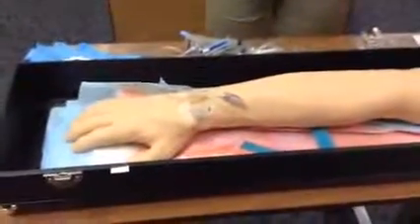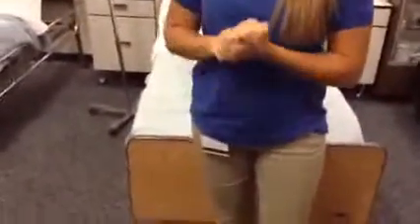Alright, so the first thing we're going to do is start by getting the medication ready. First, I'm going to wash my hands to make sure that we keep an aseptic technique. So I have my hands washed. I'm going to use my alcohol prep and clean up the medication.